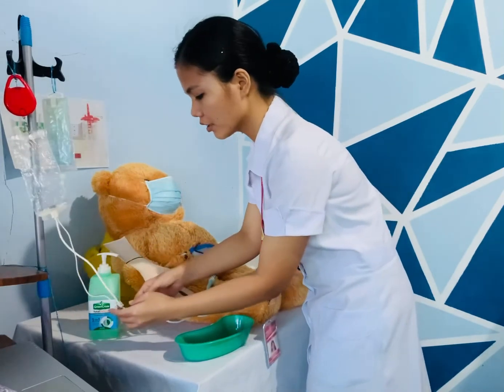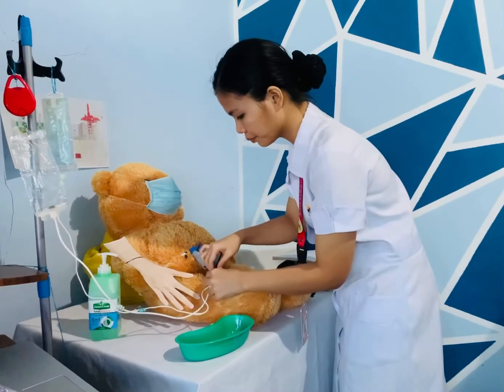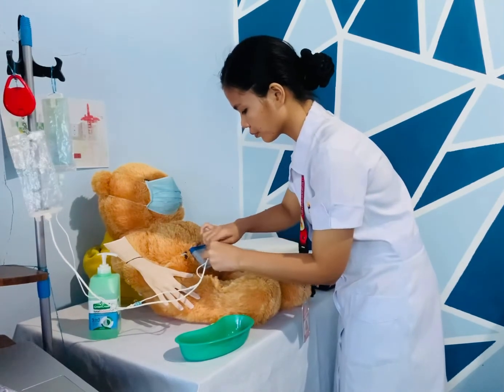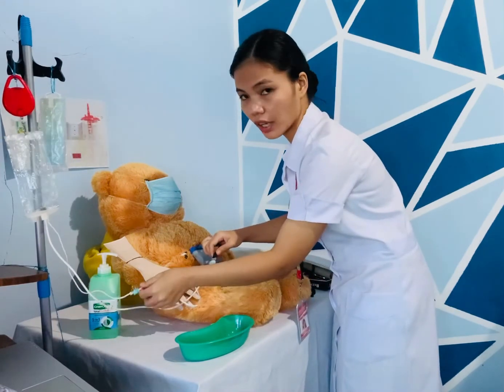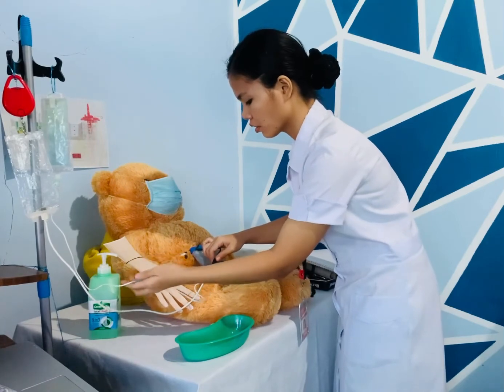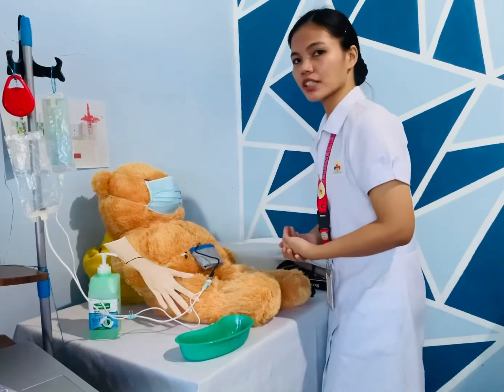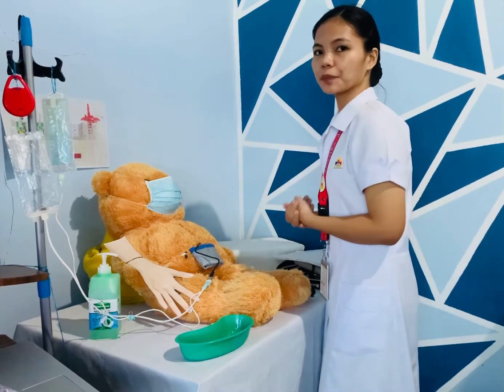So after that, open the twist clamp of the transfer set. Then open the blue clamp on the fill line. So filling of the new dialysis solution takes about 8 to 10 minutes to complete.